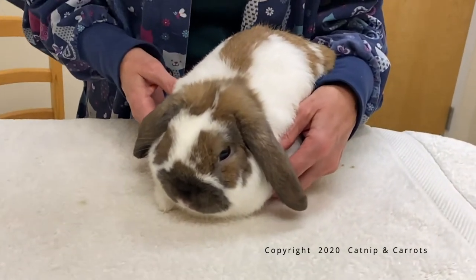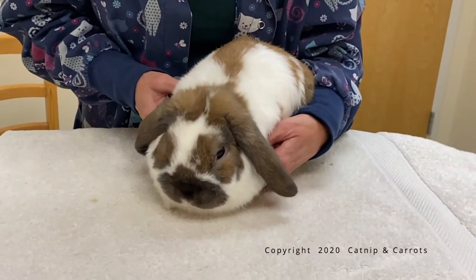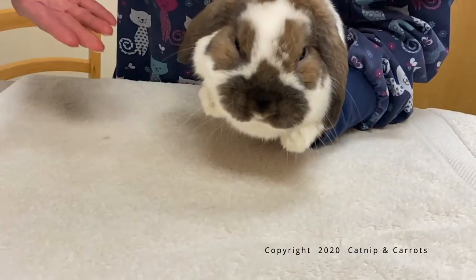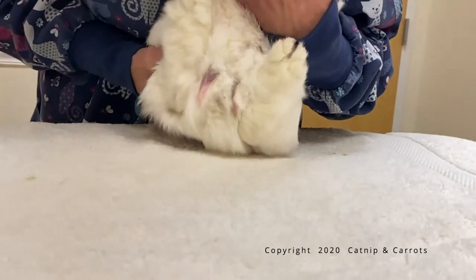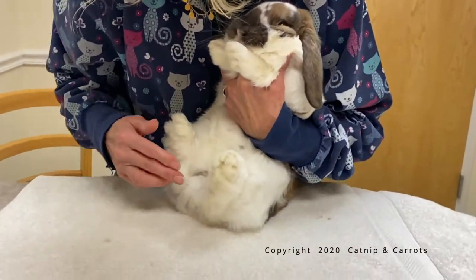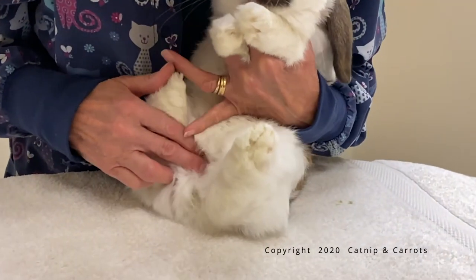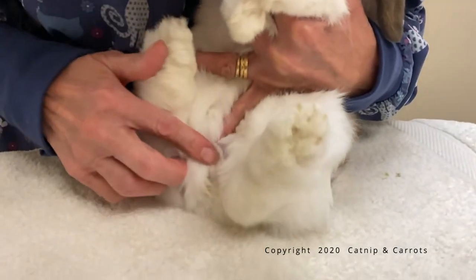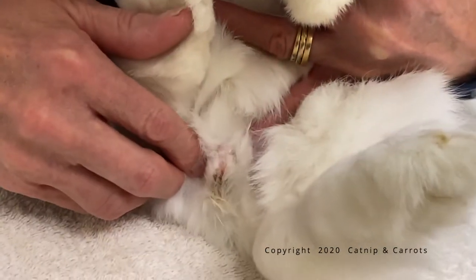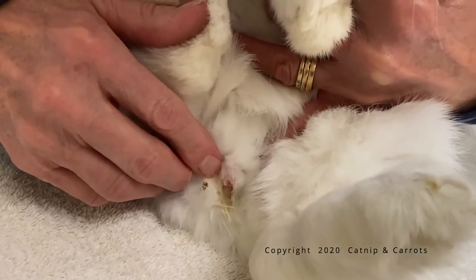For this, you're going to hold the bunny up next to you because you have to be able to see his rectum. What I'm doing is taking my hands, putting them under his chest like this, and then tucking my hand under him so I can see. I'm holding him against my body so I can see his testicles right here, and his rectum and penis down here at the bottom. This is so that you can do this yourself — there are other ways, and we'll show you an alternate way. So here's his penis down here; it's this nice pink thing.